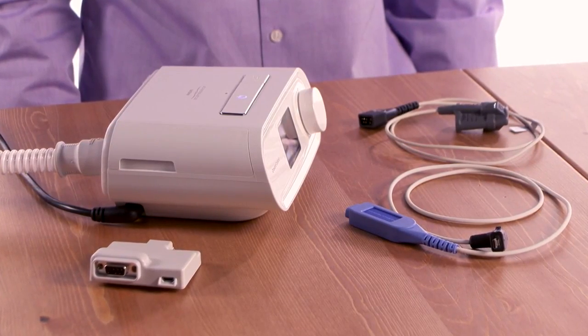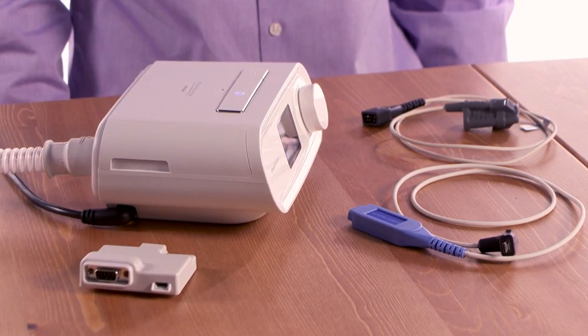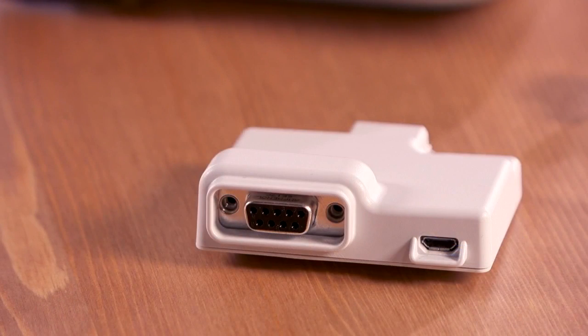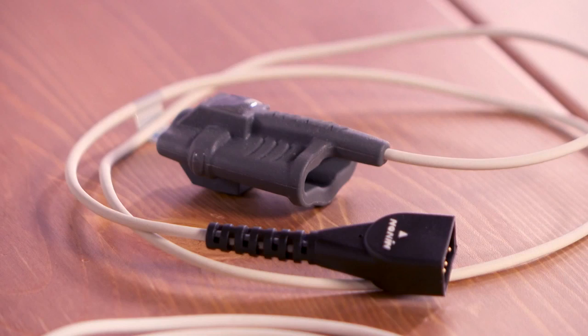Your therapy device is capable of collecting oxygen saturation and heart rate data with optional oximetry accessories. An oximetry system is comprised of three parts: a link module, an oximetry module, and an oximetry sensor.